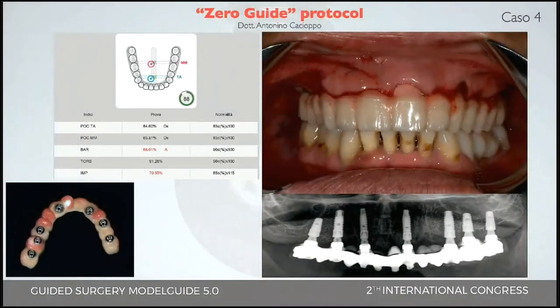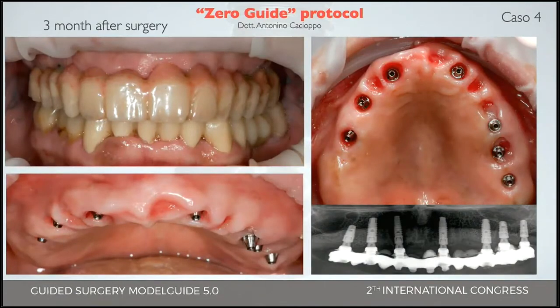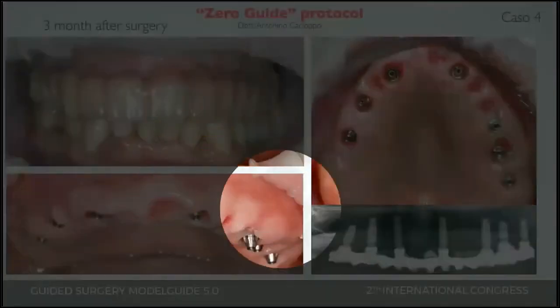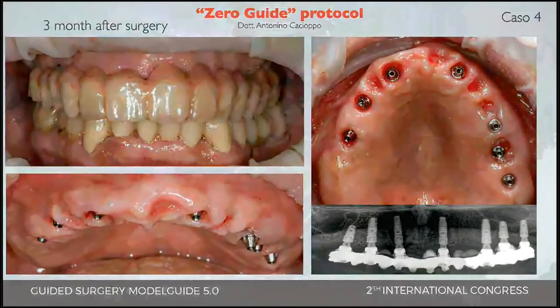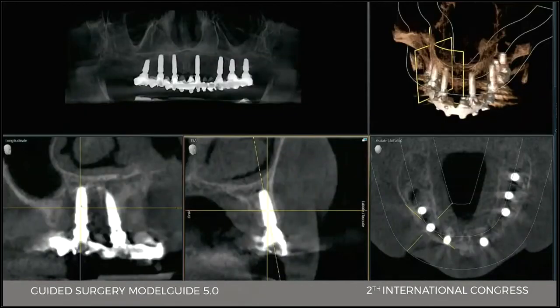This is because it was a long day and the patient was absolutely not so good. But I started managing the provisionals with clinical checks, managing, of course, the gums, and I had my X-rays to see if I had bone loss. 3D examination.